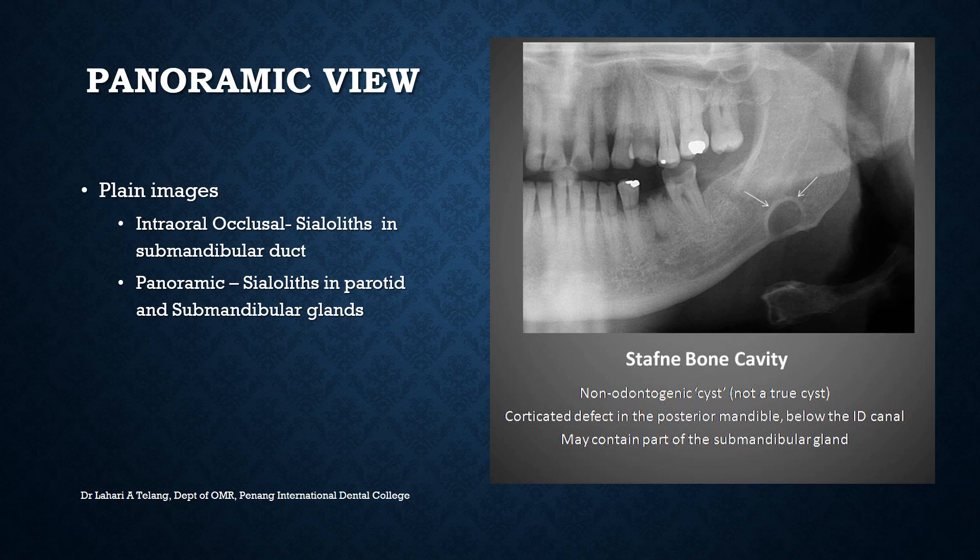What you are seeing on this image is a cropped panoramic view showing a Stafne bone cavity. It is not a true cyst — it is a corticated defect in the posterior mandible below the inferior dental canal, and it may contain part of the submandibular gland.